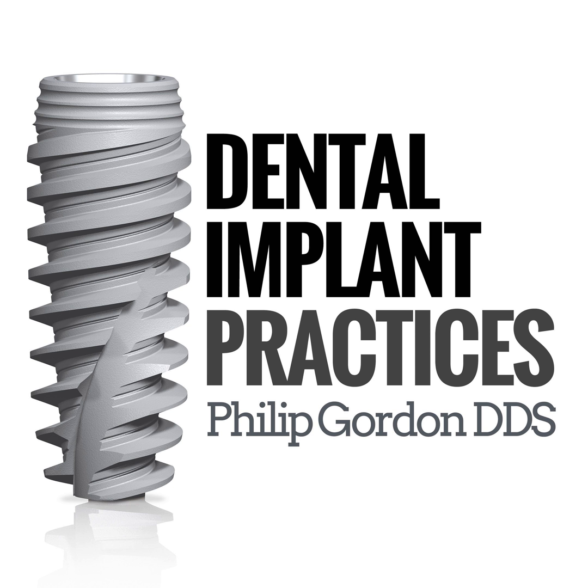I can take 10 implants, transfer them in an arch, and do a one try-in, and it fits like screws in a Swiss watch. And people have come and watched me do that. But there's a certain way when I take that impression, I make sure that I seat the transfers on the analogs in the impression.